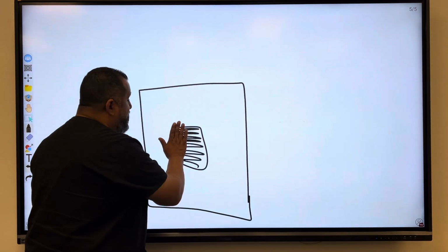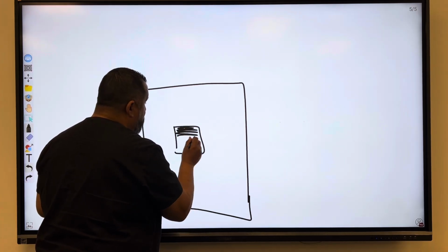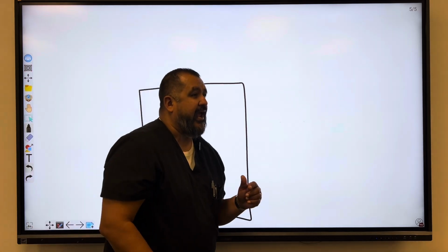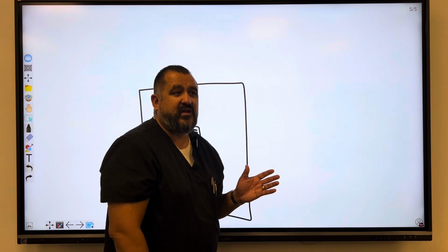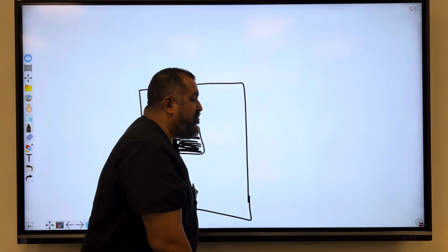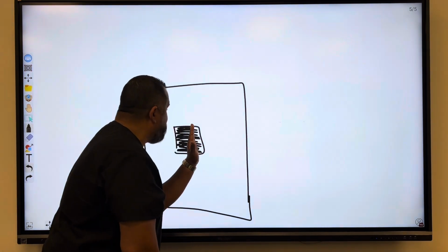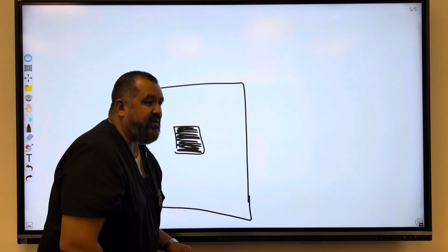So let me give you an example, because one of my students just recently said, Mr. M, I did this lateral C-spine, and I used AEC, and the image was underexposed. And I said, well, can you send me the image? No patient information, of course, right? I said, send me the image. And when they sent it to me, what I noticed was that the centering of the C-spine was off a little bit. The C-spine was not lined up over the chamber.